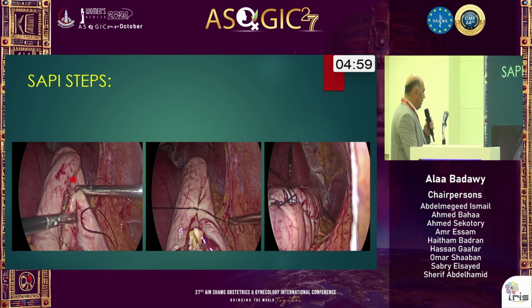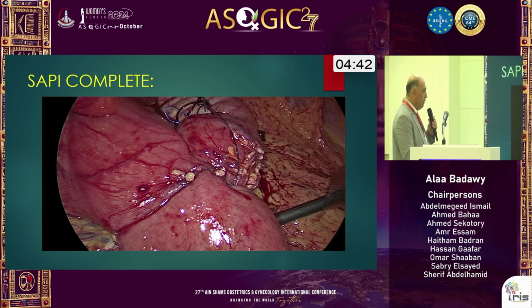Just after greater curve dissection, do laparoscopic sutures in a 4 in 1 pattern, so that we have 2 here, 2 here, and then suture it, and then the second row continues. And this is the most important. Here is the plicated stomach, antrum. This is a gastroileostomy in a bipartition way.